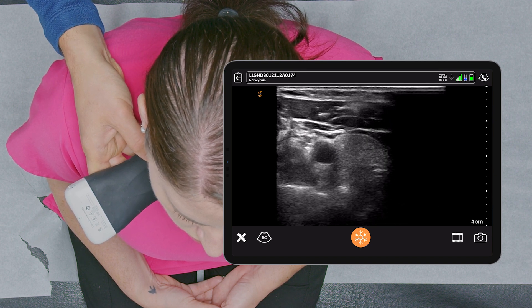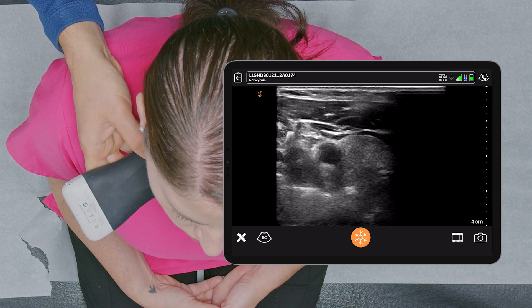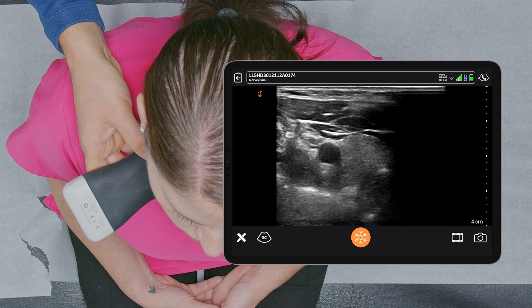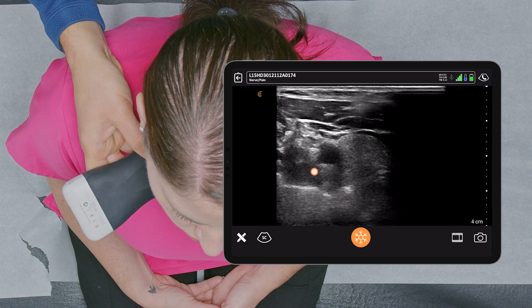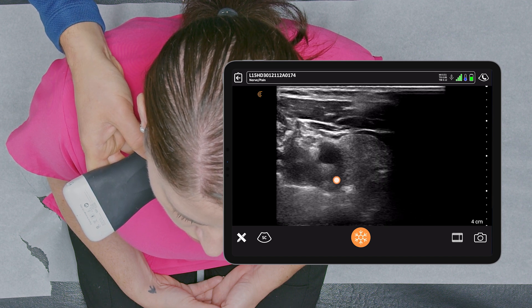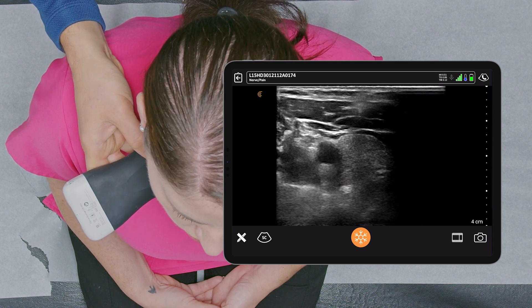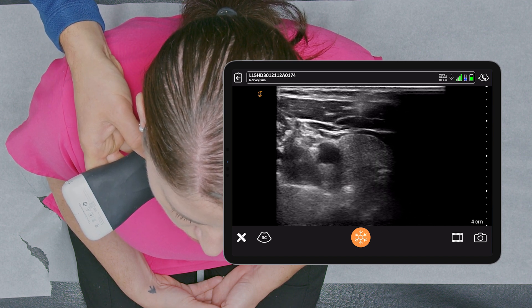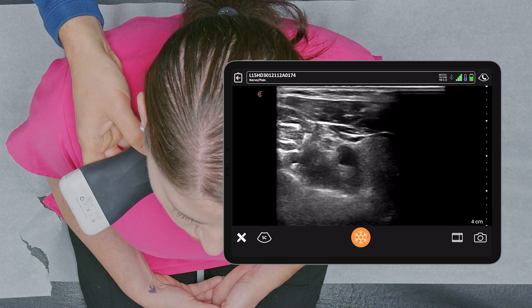The longus colli muscle is here, lying on top of the cervical transverse process at the bottom of the screen.